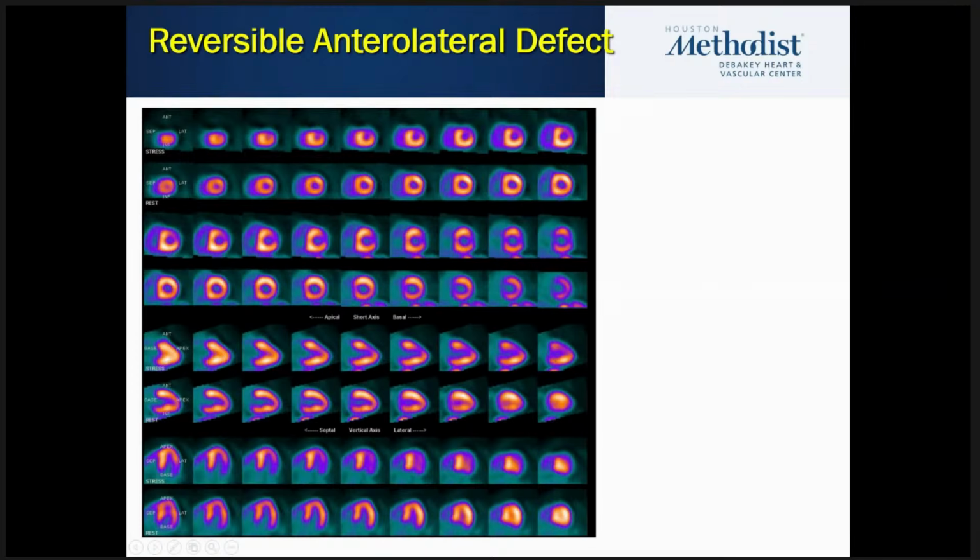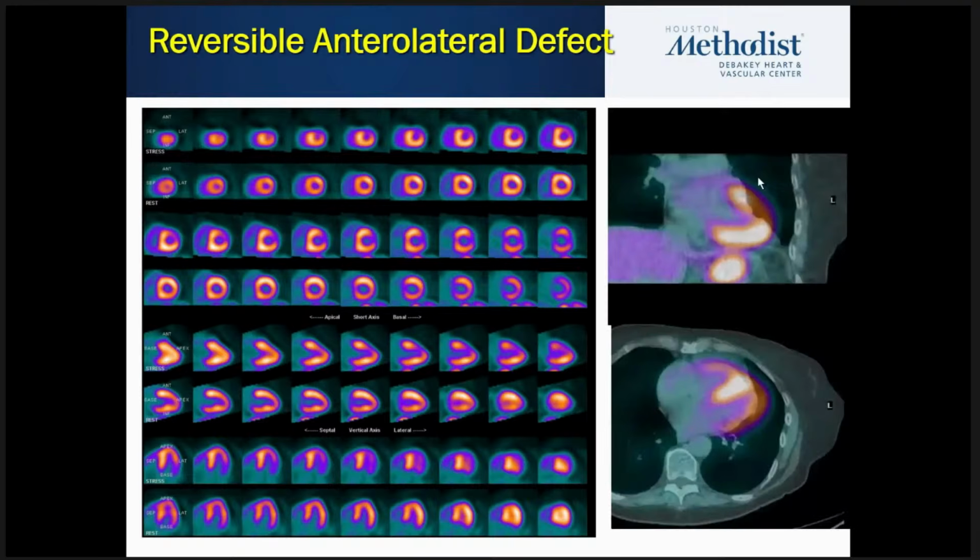When I go ahead and look at the fusion images, where I fuse my CT and lung tissues, CT and cardiac PET images, I see that the heart is not where it should be. So I'm correcting the heart for the attenuation coefficient of the lung, assuming that the heart is sitting over the lung, which is not true.